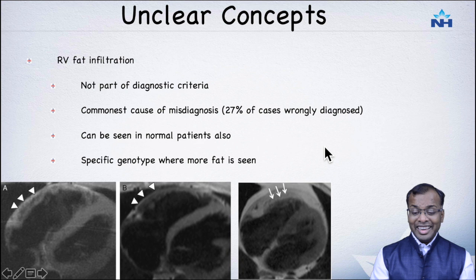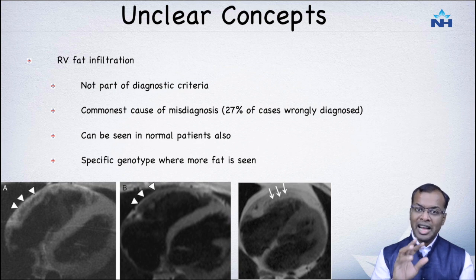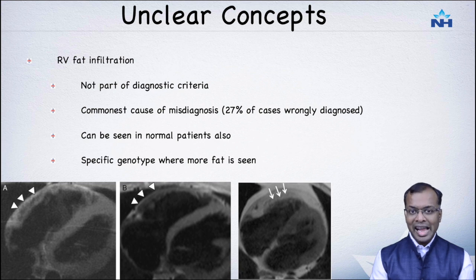Okay, it is something which can be seen in normal patients also. There is a lot of fat in the pericardium, epicardium, which could mimic that of a RV free wall. So one has to be very careful when it comes to diagnosing that. So please do not look for fibrofatty replacement of RV free wall in cardiac MR or CT at this current moment.